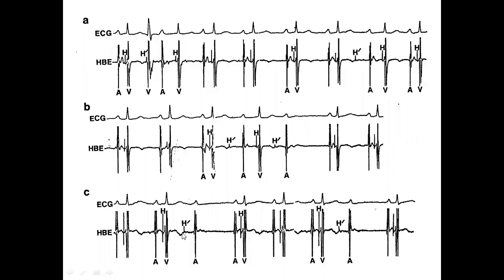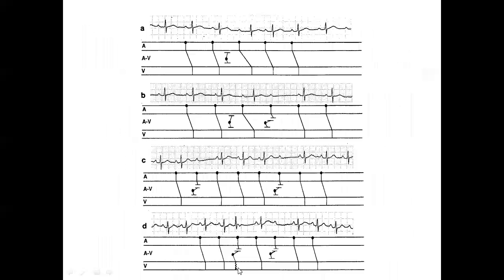Here, junctional premature beat, next P is blocked. Junctional premature beat, next beat is blocked. Looks like a type 2 second-degree AV block. So I will call this a pseudo-AV Wenckebach phenomenon. Now, you truly heard the A to Z of a Wenckebach phenomenon, including pseudo-AV Wenckebach phenomenon.